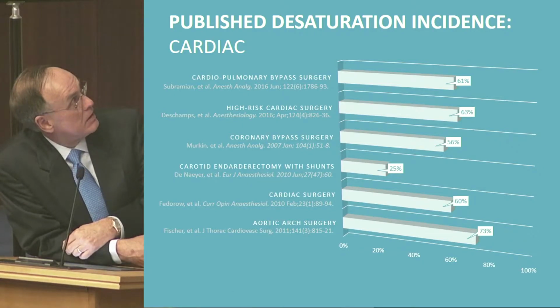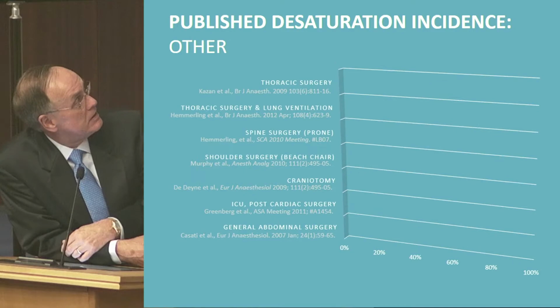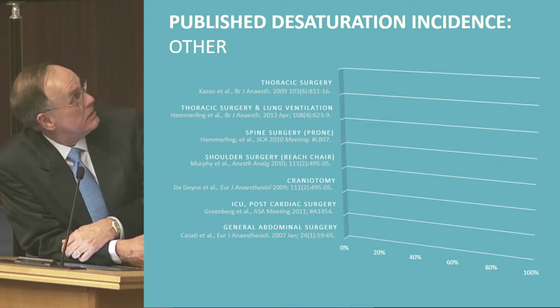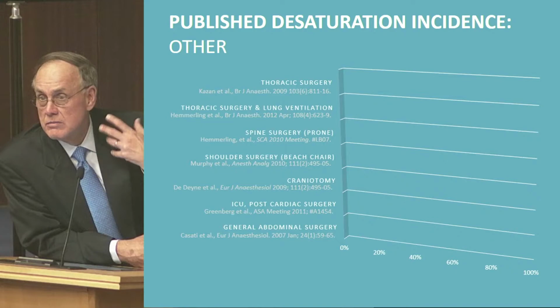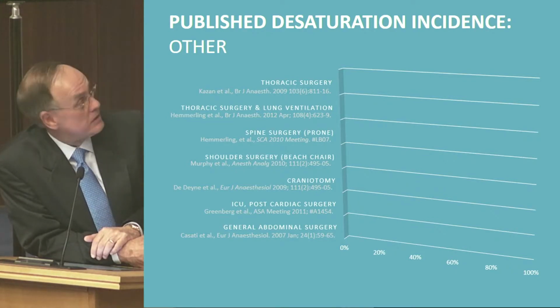Now, for those of you that are not in cardiac surgery, we also looked at other operations. We looked at thoracic surgery. We looked at single lung ventilation procedures where only one lung is needed or used to support the patient.